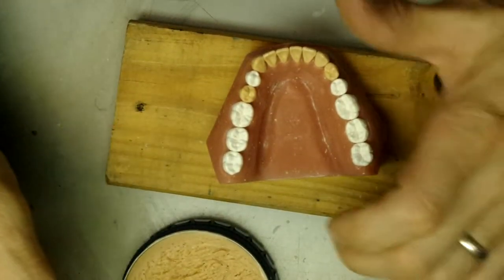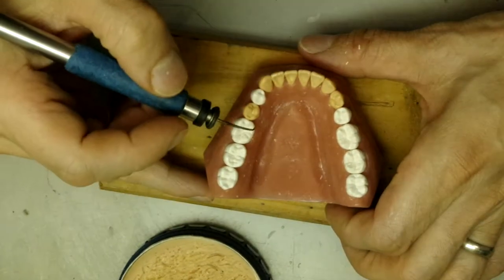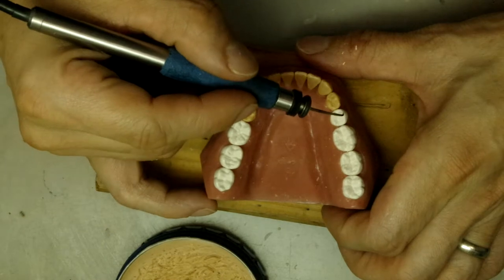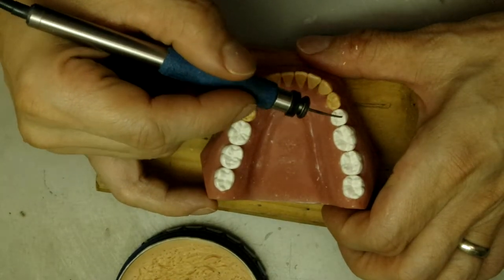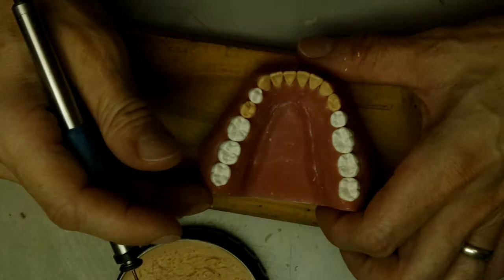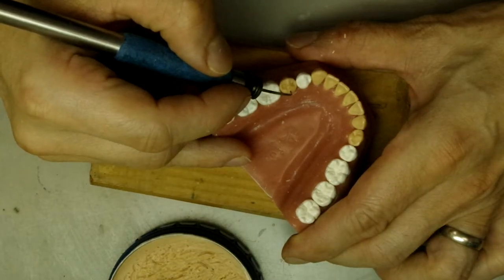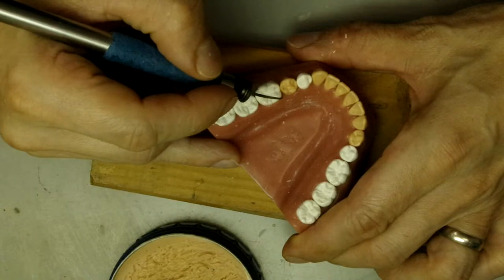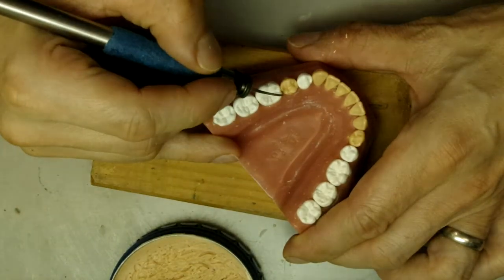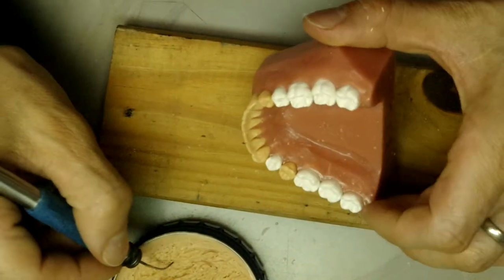After looking at it for a little bit, I noticed that I waxed these teeth a tiny bit too flat. You see how it's a little bit more wide from buccal to lingual — it's a tiny bit narrower. So I'm going to increase this a little bit on the lingual. If I don't do this, I'm not going to be able to sleep. So let's just fix it.